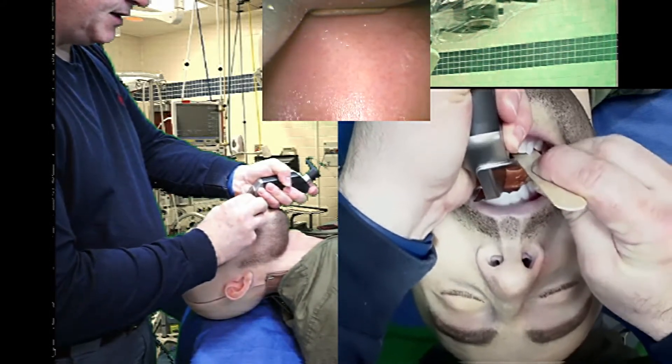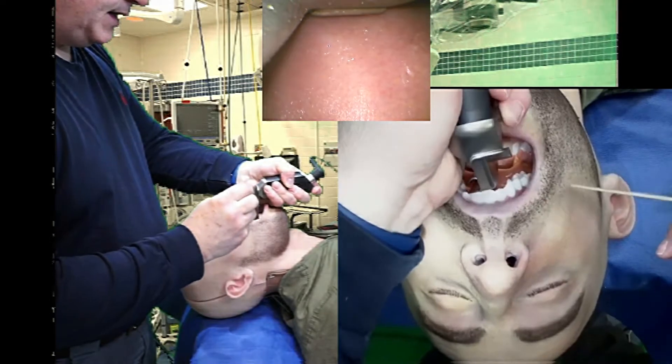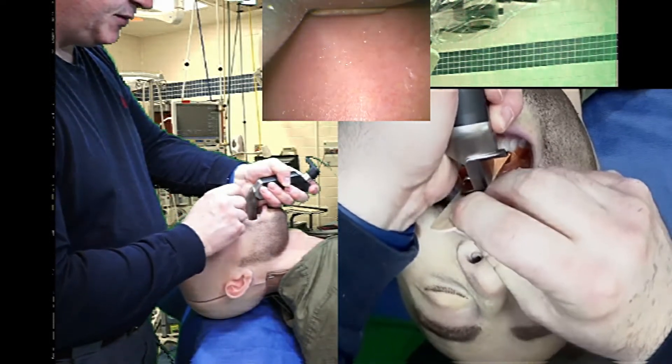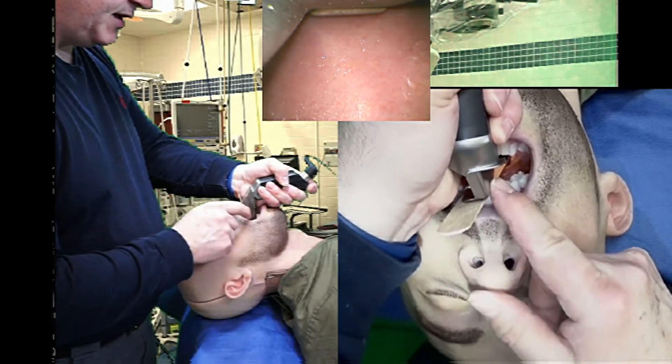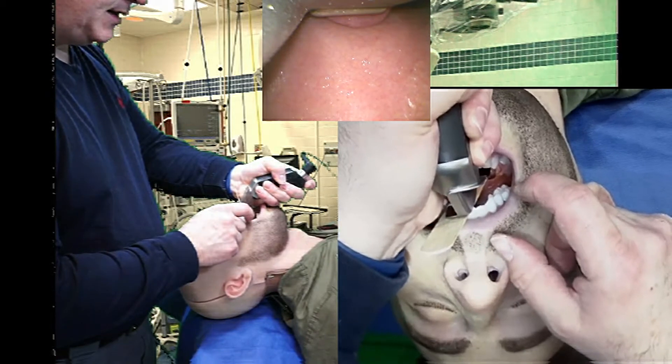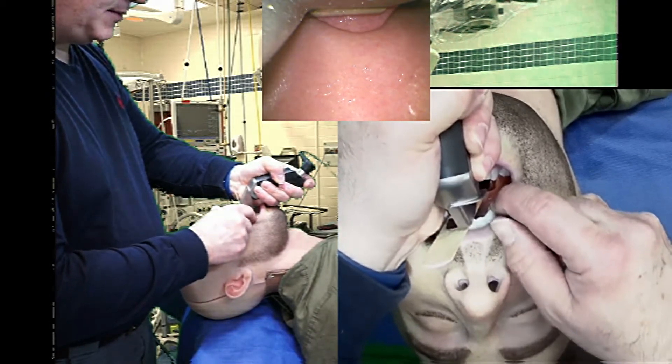Now that I don't need that tongue depressor, I'm going to take it out. If I need to protect the upper dentition, I can leave the tongue depressor between the laryngoscope and the upper dentition. What I'm going to do now is concentrate on getting the view.